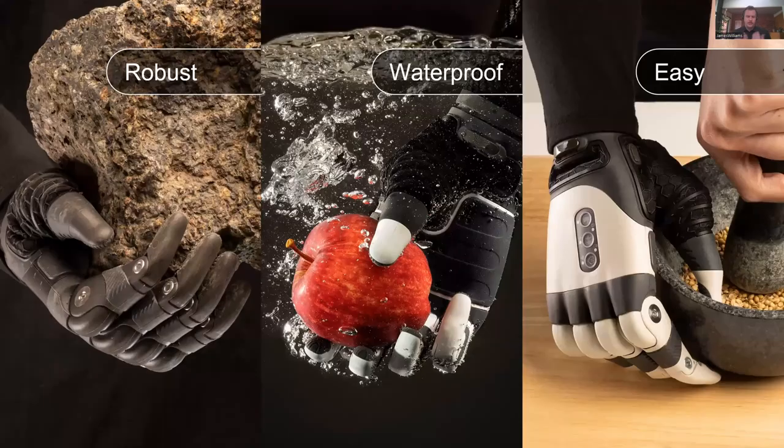I want to talk about what's common between all of our products — our three key pillars: robustness, waterproofness, and ease of use. Everybody would like a robust, reliable prosthesis that lets them do a wide range of activities so they can get back to not being limited in daily life. That was Matt's vision and that's what we've created. Robustness means you can withstand knocks and use the hand in a wide range of scenarios with that confidence and reliability — not worrying about accidentally breaking your hand.